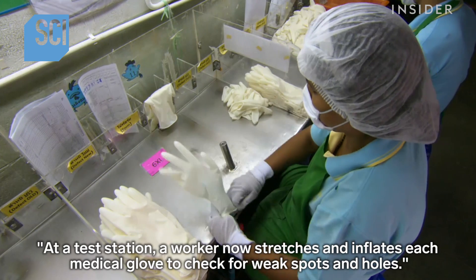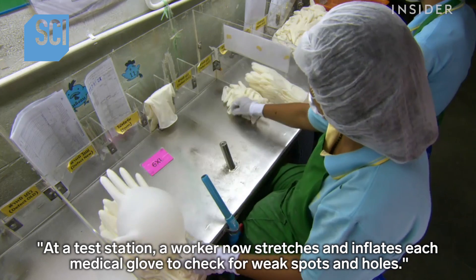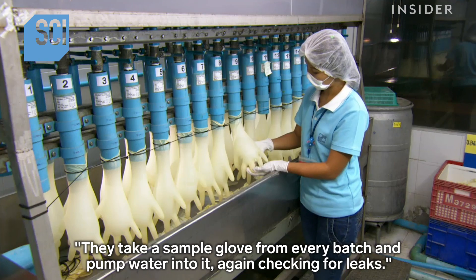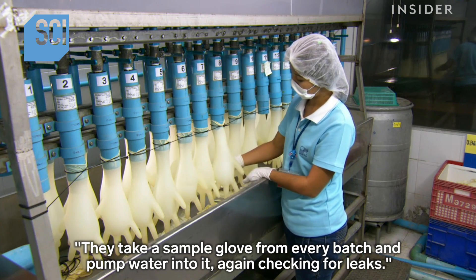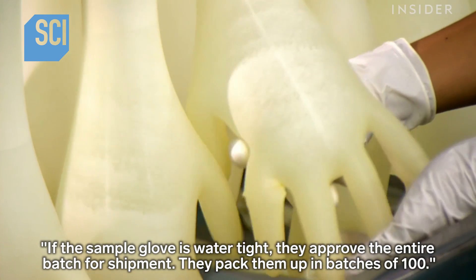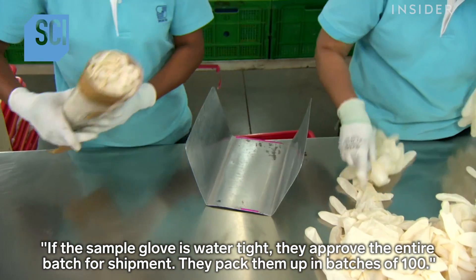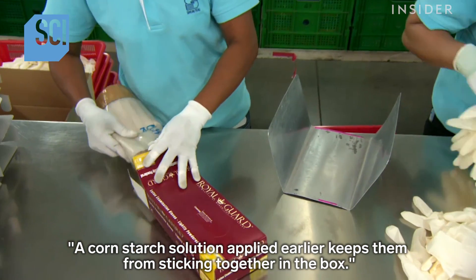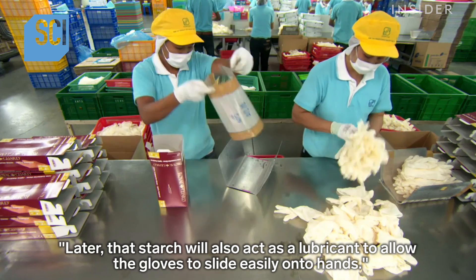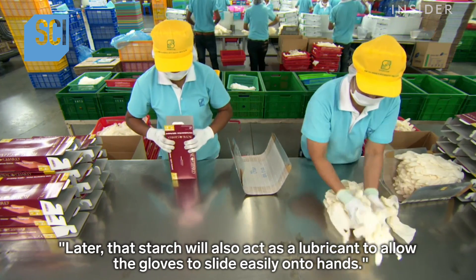At a test station, a worker stretches and inflates each medical glove to check for weak spots and holes. They take a sample glove from every batch and pump water into it, again checking for leaks. If the sample glove is watertight, they approve the entire batch for shipment, packing them in batches of 100. A cornstarch solution applied earlier keeps them from sticking together in the box, and later acts as a lubricant to allow the gloves to slide easily onto hands.